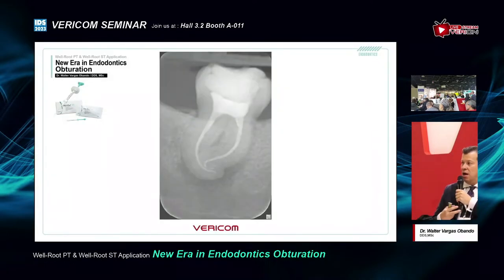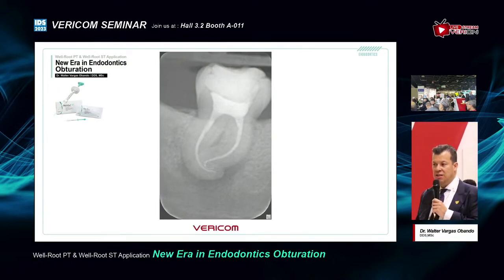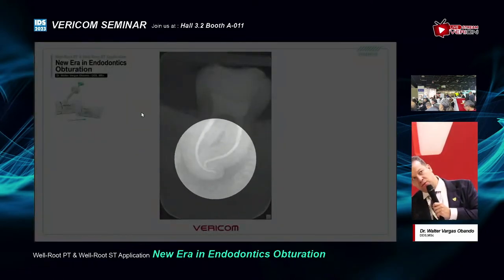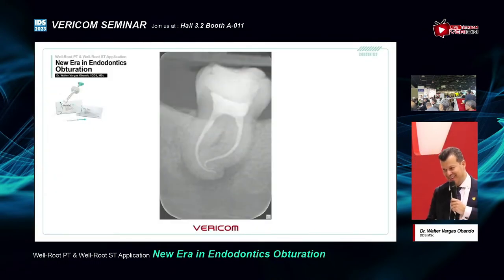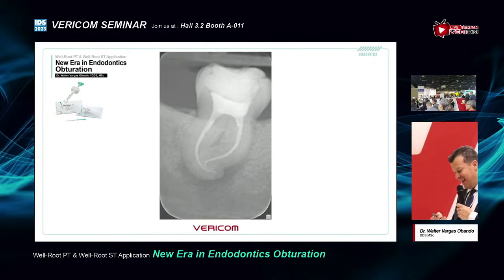Right now, I repeat, we are in minimally invasive endodontics. We are trying to remove less dental material from our tooth. And we are trying to do as best as possible. Sometimes, if you're trying to do a continuous wave technique, it's really difficult to do this. But sometimes you are on your lucky day. Okay, this is not real life. Believe me, this is not real life. It was done by me, but I'm a lucky guy sometimes, and I have lucky days.